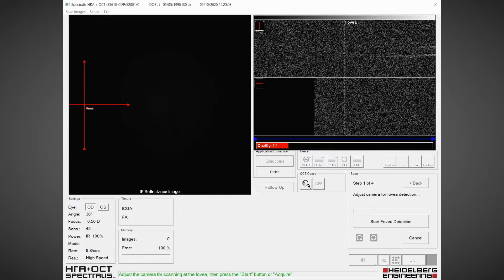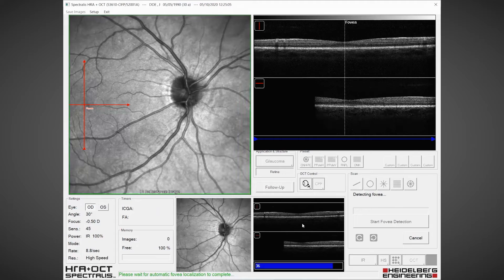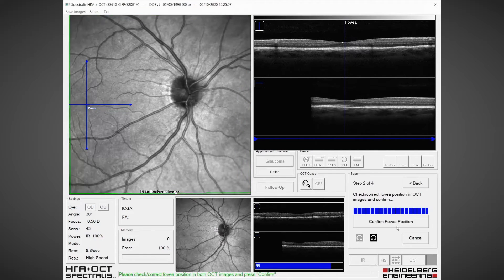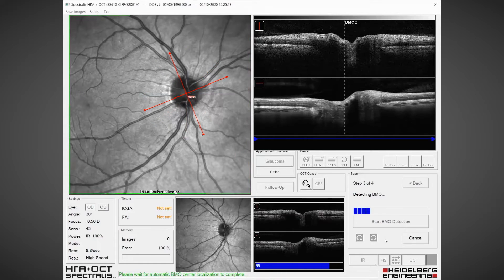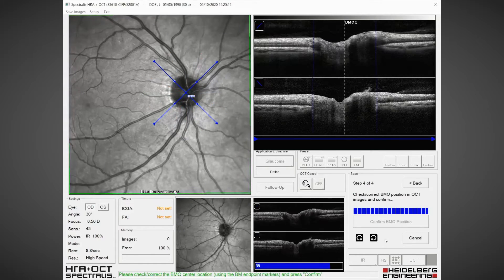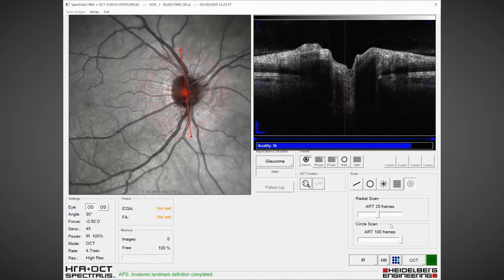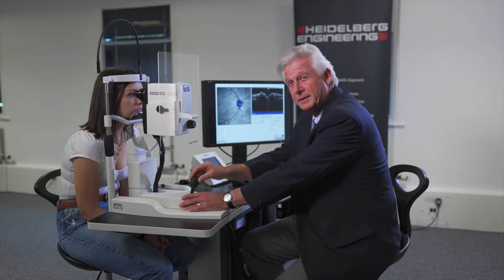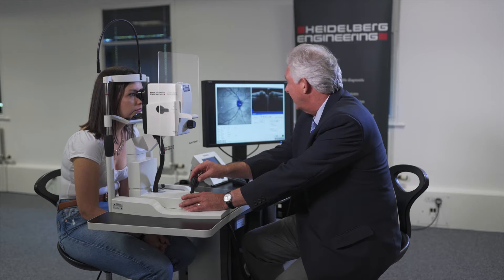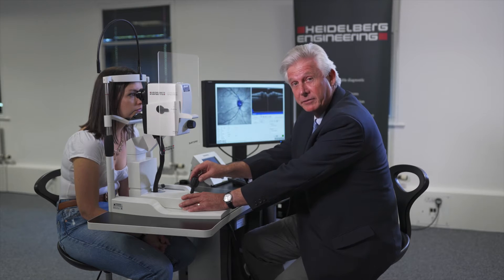We start fovea detection, wait for the blue bars to complete, and confirm that position. Then we move to the optic nerve, start BMO detection, wait for the blue bars to complete, and confirm BMO position. The anatomic positioning system fixes the location of the fovea to the centre of the optic disc for every individual patient.